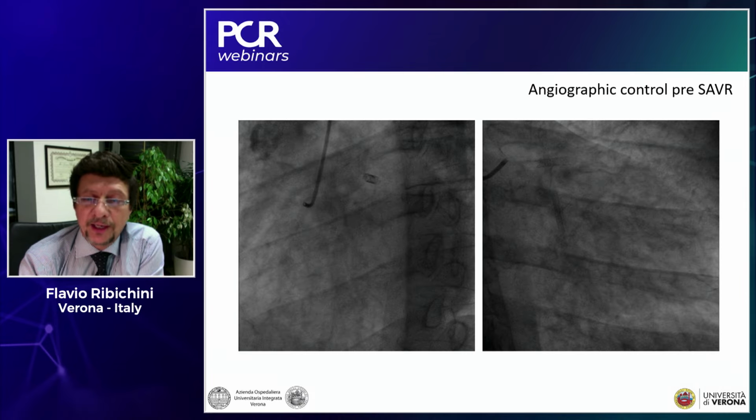And at a certain point here exactly, an under-expansion due to the 360 degrees calcification. But despite that, the patient did not have angina any longer, thanks to the long-term efficacy of the DCB therapy, and underwent aortic valve replacement. So, Bruno, I hand it to you to explain to us the mechanism, the classifications, and the clinical implications and predictors of in-stent restenosis.